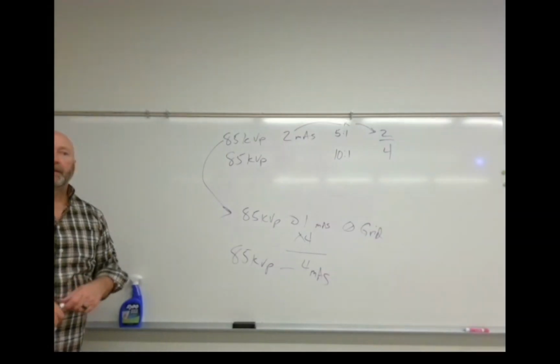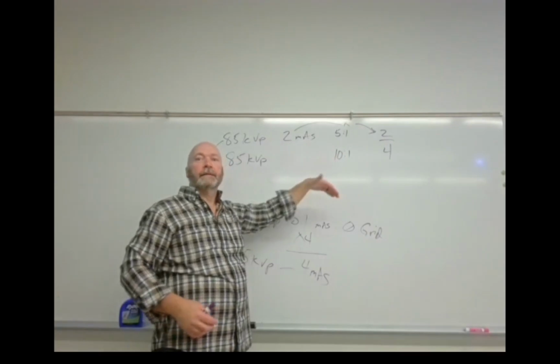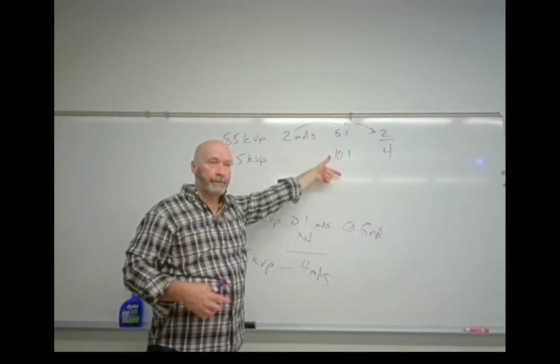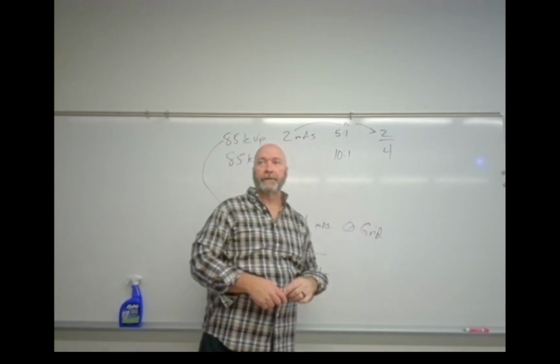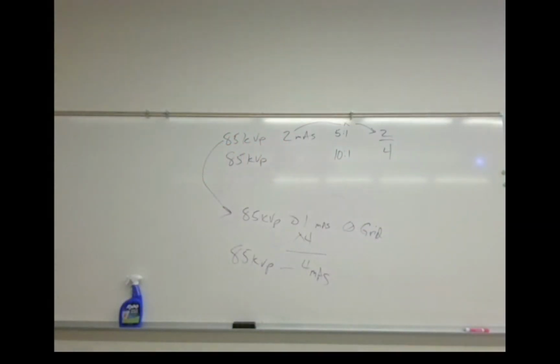Okay? So the higher the grid ratio, the more lead it has, the higher the Bucky factor, the more exposure to the patient, right? The more cleanup it's going to have, so the greater the mAs value you're going to need. You all good with that?